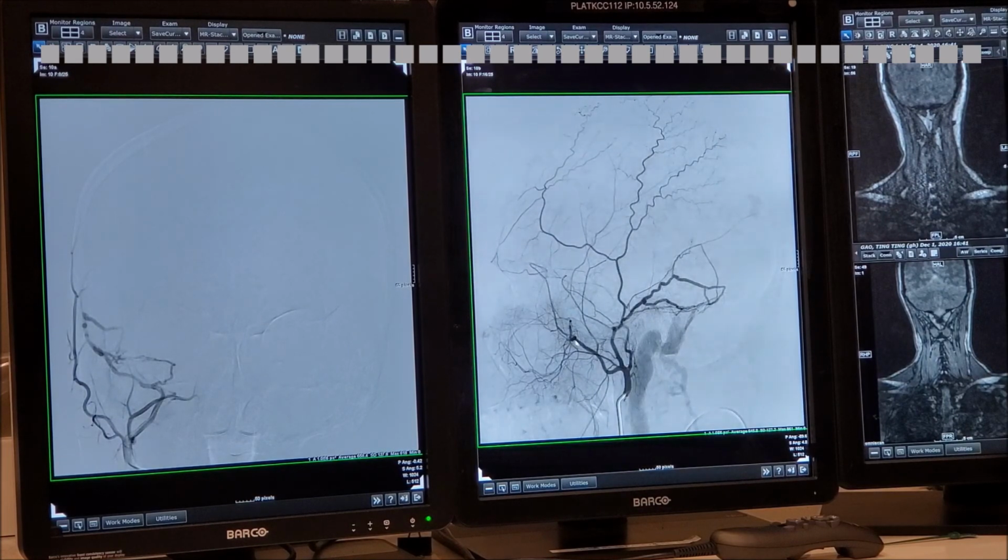You see here the anterior deep temporal comes towards the orbit. And let's see, yes, here it is. Here it comes towards the orbit. So that's going to be furthest, the foramen will be there. Nice variation of the meningeal branch.